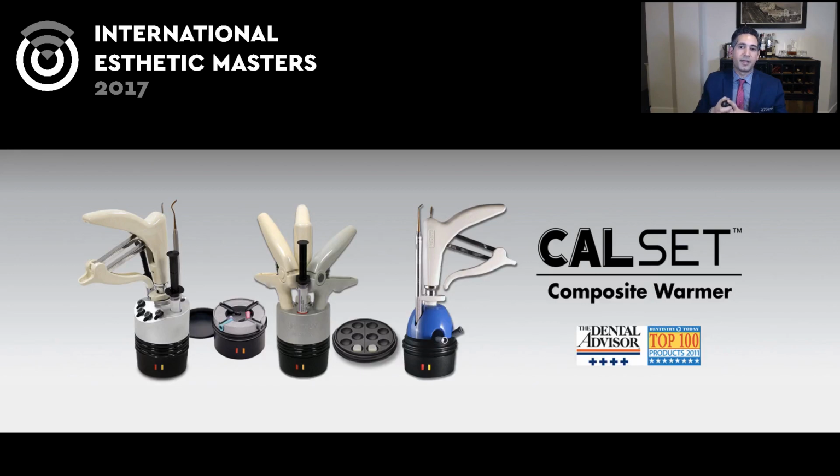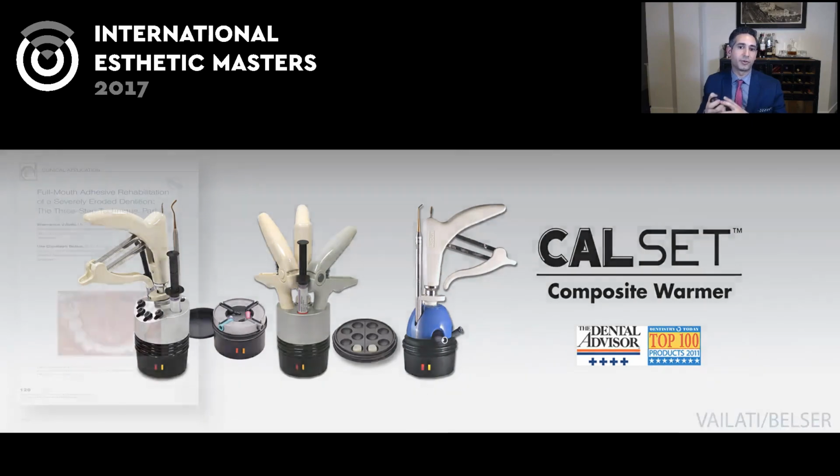And the posterior tooth, the last molar, acts as a stop so that you can seat the putty and have a very accurate replica of this wax up. What you're going to want to do when you do this, so in their technique they use the composite in the mouth. So I like to use a Calset warmer when I want to use composite, especially for cementations. When I use composite, which is part of the technique that I use all the time, heating the composite makes it a lot more flowable and less viscous, so you can work with it.